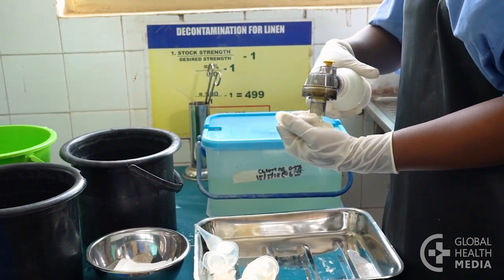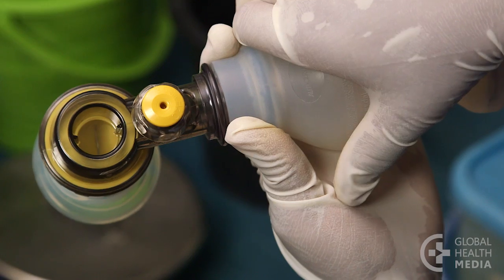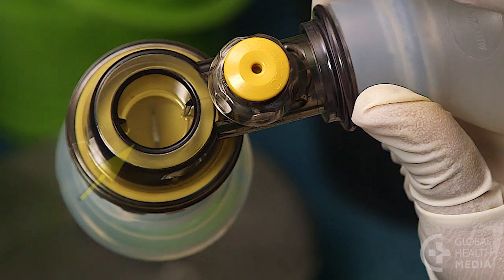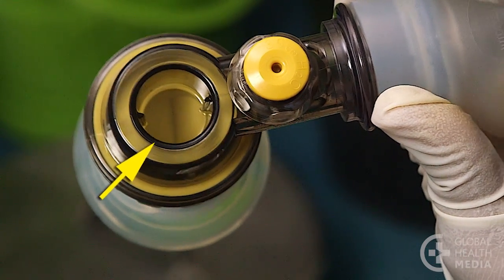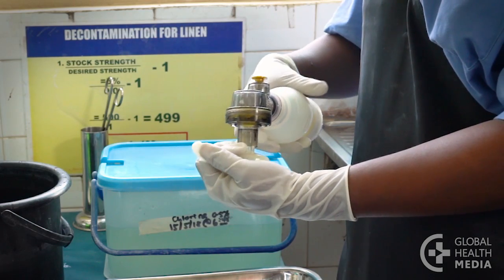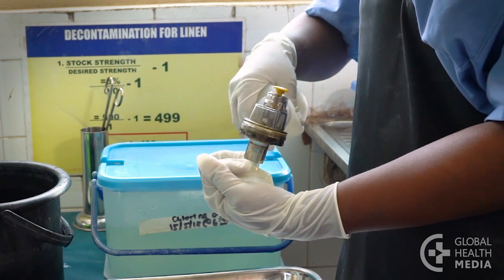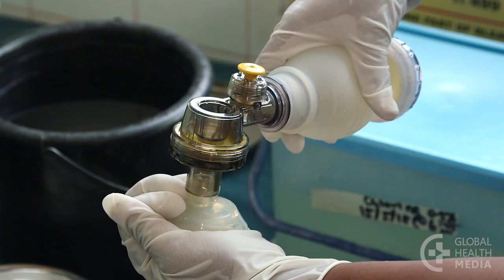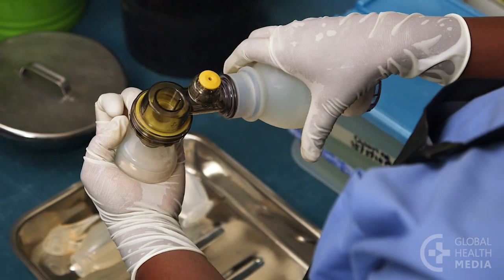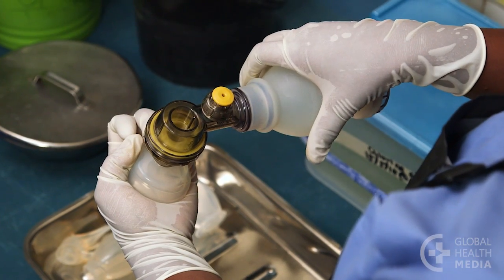Now test that the equipment is working well. First, squeeze the bag and watch for the valve to open and close. Next, make a seal with your palm and squeeze the bag. You should feel pressure against your hand. See the bag reinflate and hear air escaping from the pop-off valve.